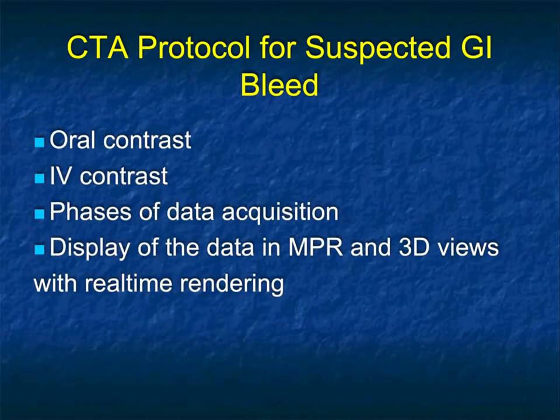Now, what about protocol? Protocol, we agree, is everything. And you know what I'm going to do? Let me stop here and let's start next time with protocol. Again, there's no surprise what I'm going to tell you. No positive oral contrast, fast IV injection, dual phase imaging. Look at images with axial and coronal and MIP and volume rendering. But let's do this. I told you that. That's just a secret between the two of us. Let's come back in a few minutes and pick it up from there.